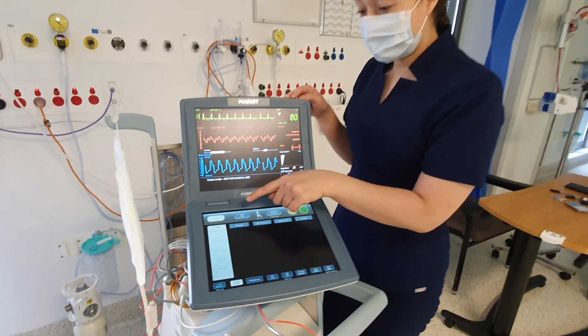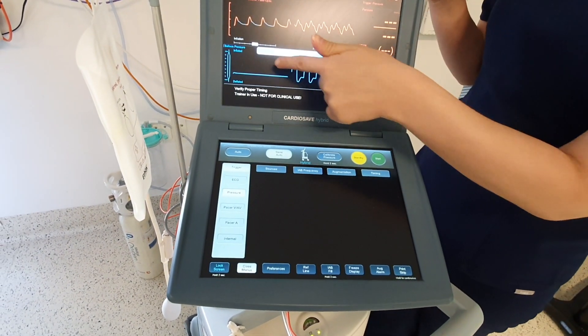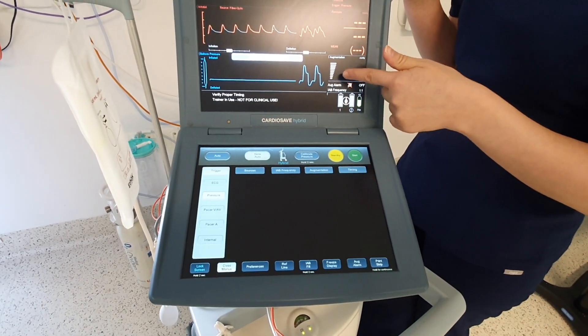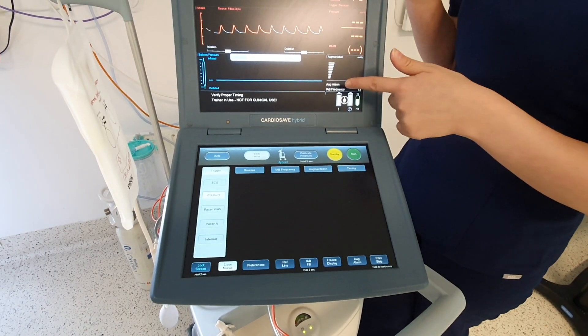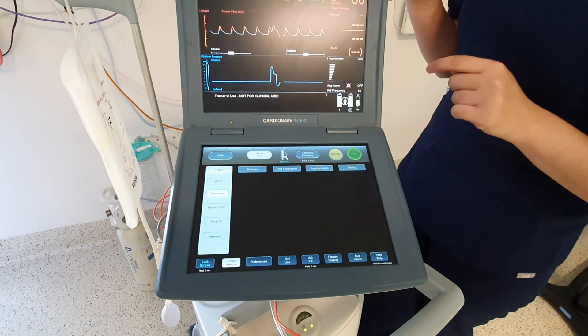To do this, select semi-auto and then select pressure. Whilst you're doing this, the balloon pump will go on standby, as you can see by the flat helium waveform. Remember to hit start — the green button here — and it'll start up again.